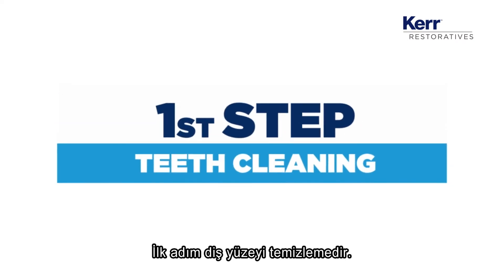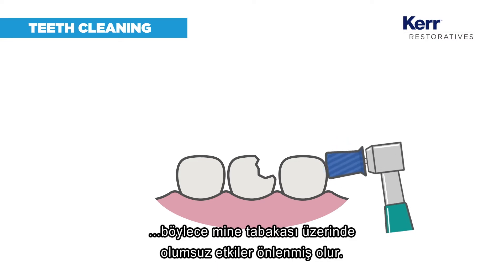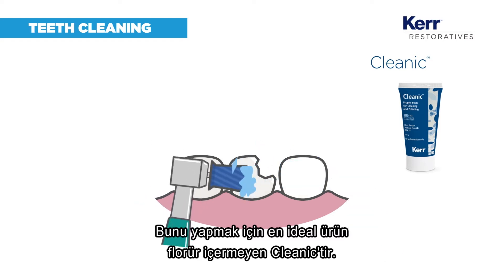The first step is teeth cleaning. A paste without fluoride is recommended to avoid negative effects on enamel etching. Cleanic without fluoride is the ideal product to do this.